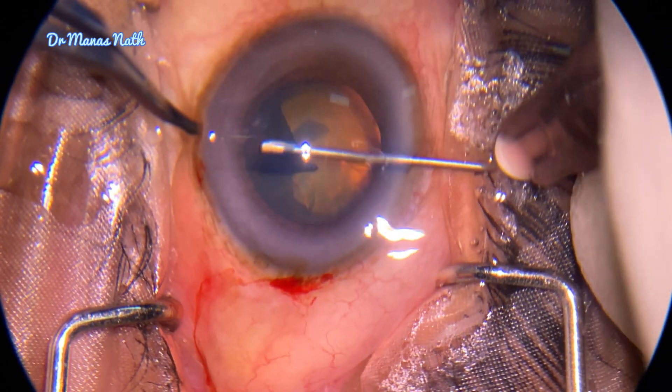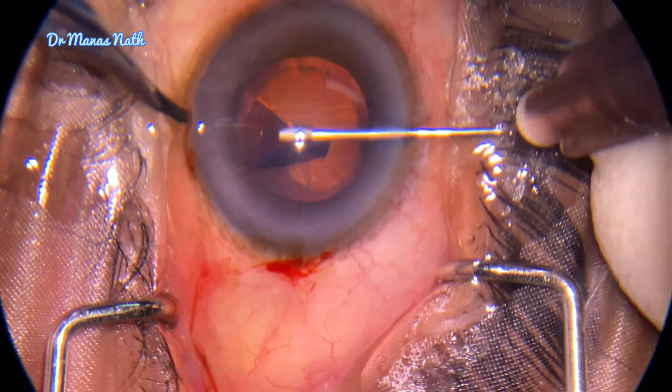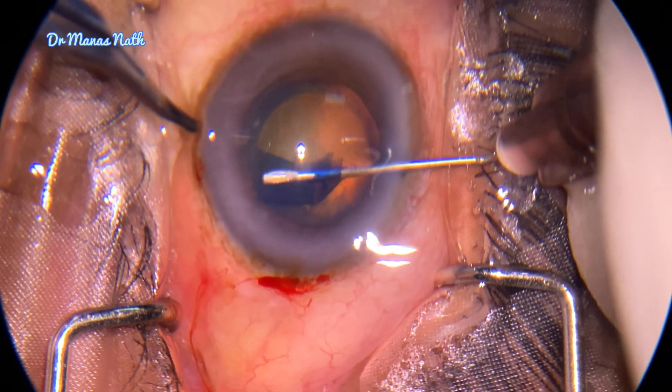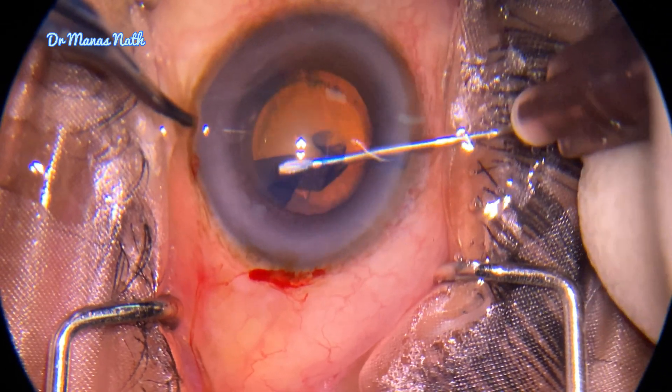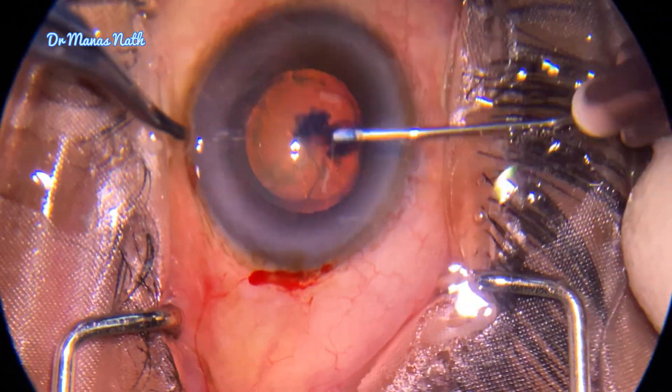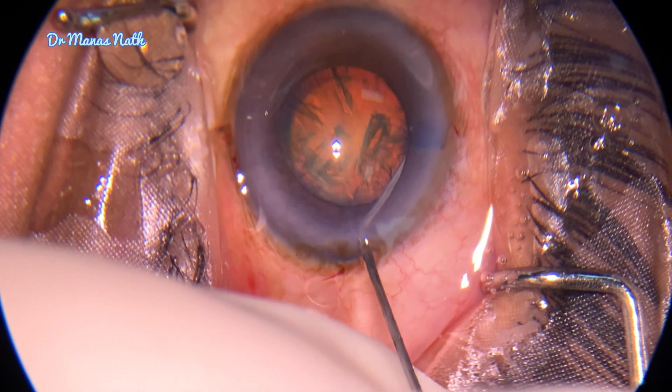If the rhexis becomes small in case of generalized weakness of zonules, surgery will be quite difficult. I think the rhexis is around 4.5 to 5mm, which was quite manageable.